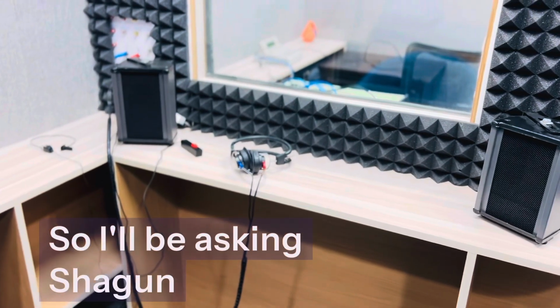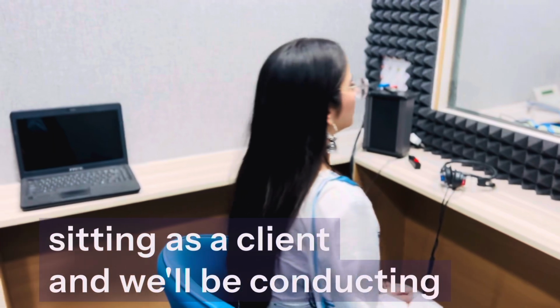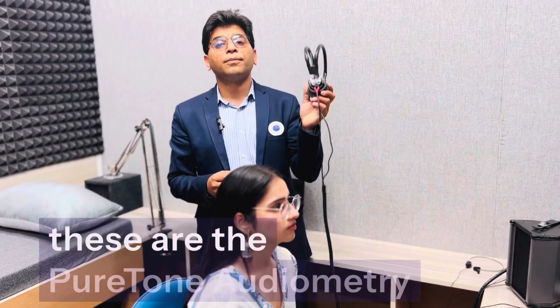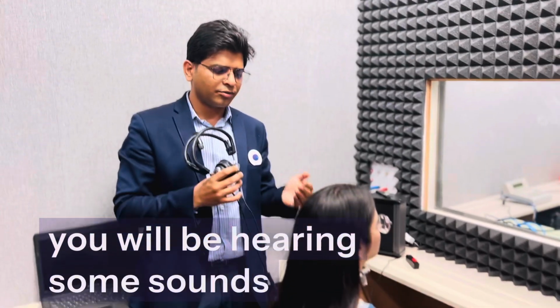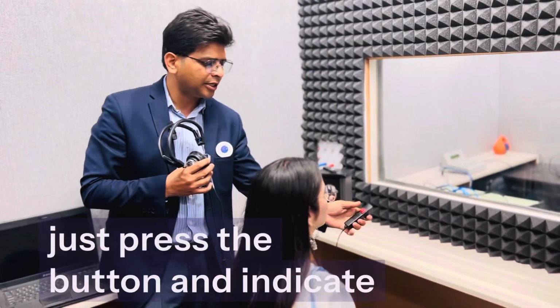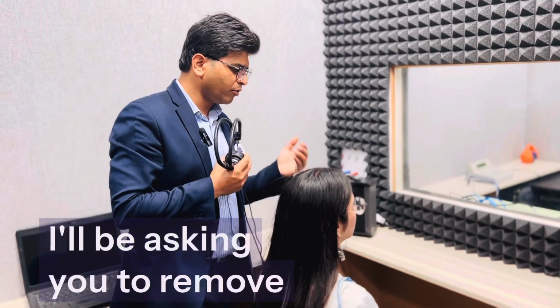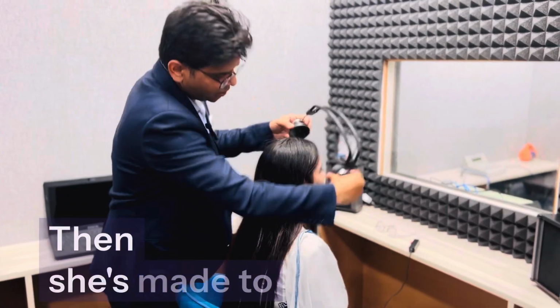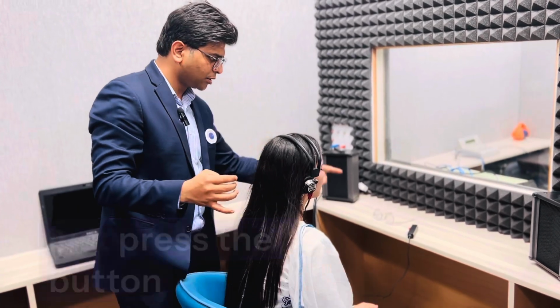So I'll be asking Shagun. Shagun, please come. Shagun will be sitting as a client, and we will be conducting the audiometry test for her. These are the pure tone audiometry headphones, and the instruction is you will be hearing some sounds. Whenever you hear, just press the button and indicate. Okay, Shagun, I'll be asking you to remove the glasses first. Then she is made to wear the headphones like this, and whenever you hear the sound, just press the button.